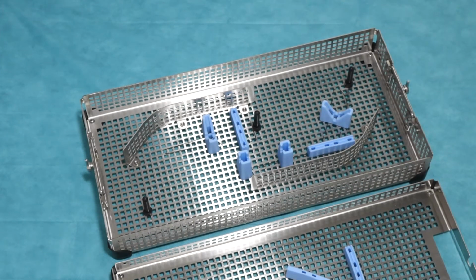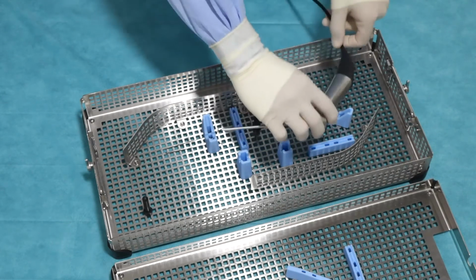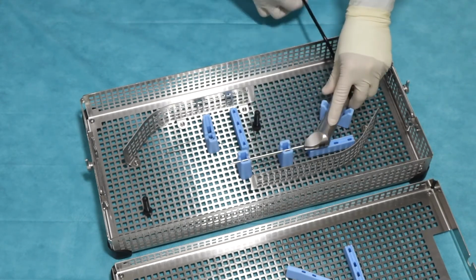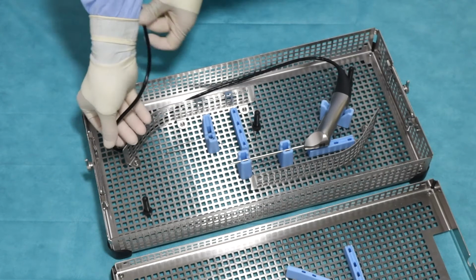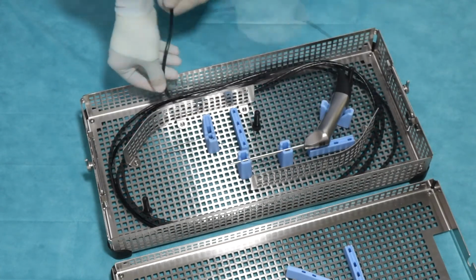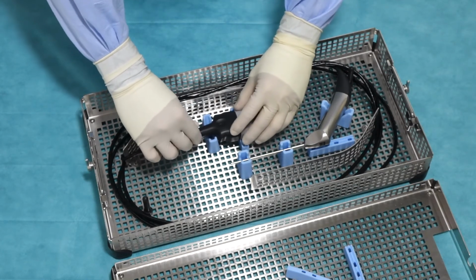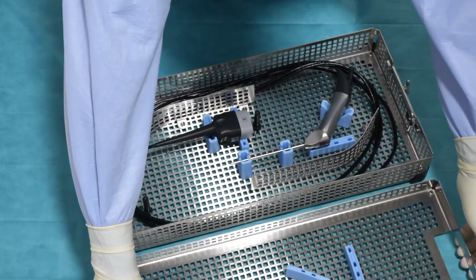After the treatment, place QEVO back in the tray again. Start by placing the device first. Then, roll the cable in the groove provided. Finally, place the plug into the blue socket. Now you can cover the tray and turn the knob away from you.